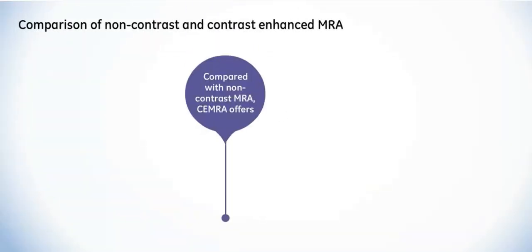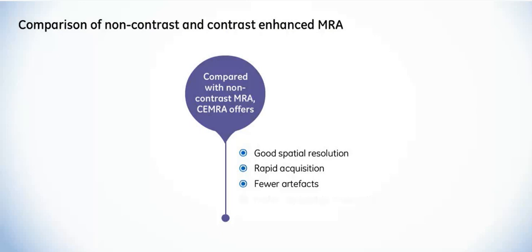Compared with non-contrast MRA, contrast-enhanced MRA, or CEMRA, offers good spatial resolution, rapid acquisition, fewer artifacts, and a higher contrast-to-noise ratio. Hence, these are more popular for MRA studies.